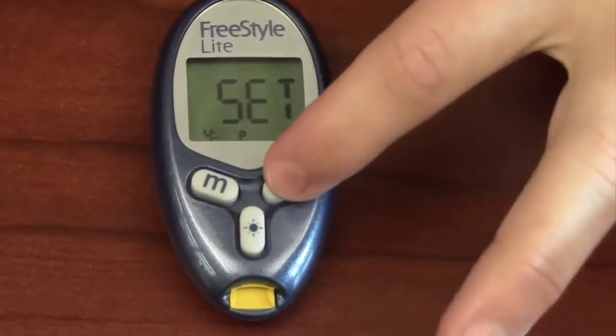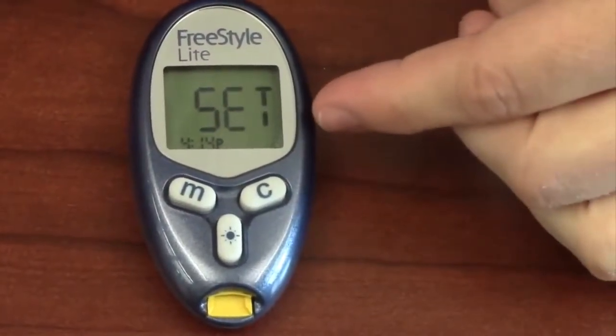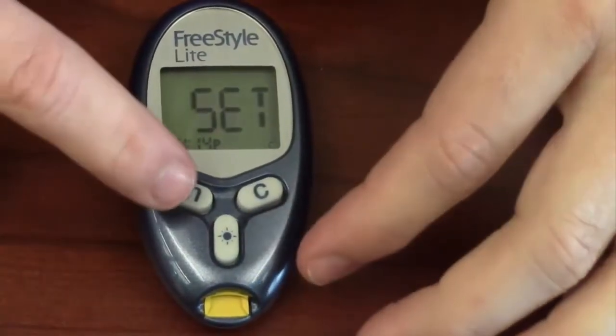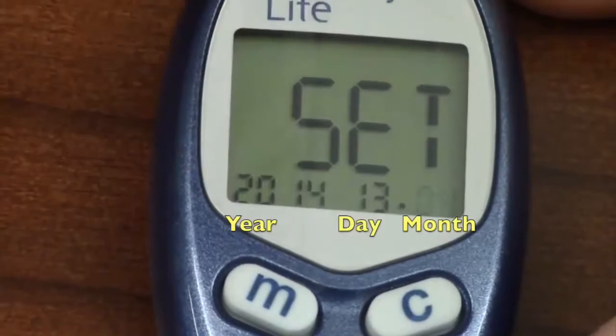You do the same thing for minutes — press C to get to the correct minutes, then press M to confirm. The 12 on screen indicates 12-hour format instead of military time, so confirm that with M. You will continue to use C and M to set the day, the month, and then the year.